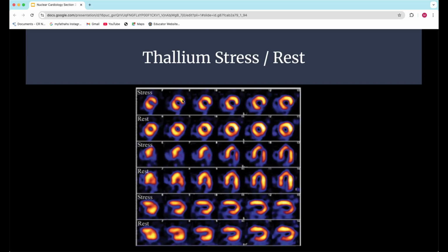Because it shows all areas of the heart have filled in. Clearly they've all vasodilated in a similar way because we get radioactivity all the way throughout the cardiac muscle, right? So there's no question to be answered. Once I have a stress scan and it's good, I'm done, right? When I get a defect, then I have to say ischemia or infarct, and I have to prove that, and that's why we do our resting scan, okay?